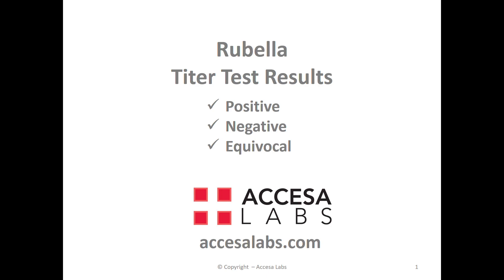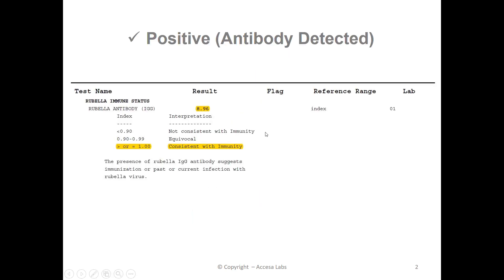Most schools and workplaces want to see a quantitative or numerical result, which can be found under the result header on the sample report. You can find the numerical result here. This sample report has a result of 8.96. Based on Quest Diagnostics Result Index shown here, any result greater than or equal to 1 is consistent with immunity. Therefore, this sample report represents a positive result.